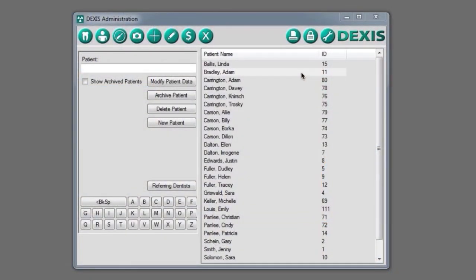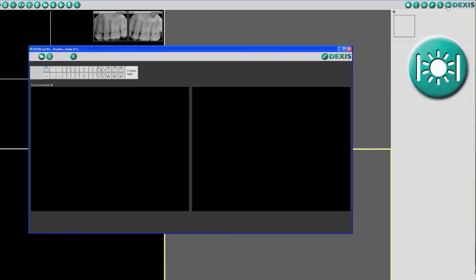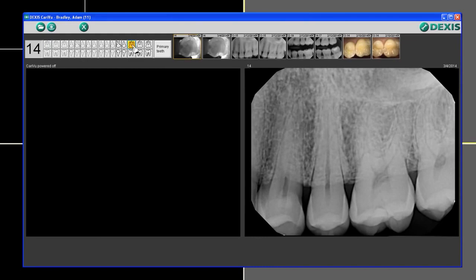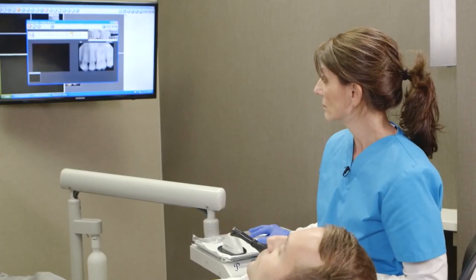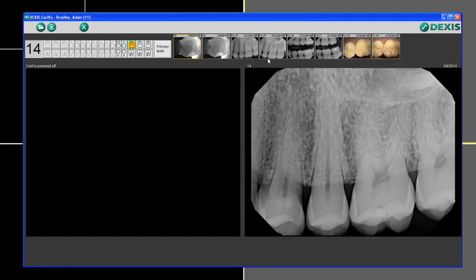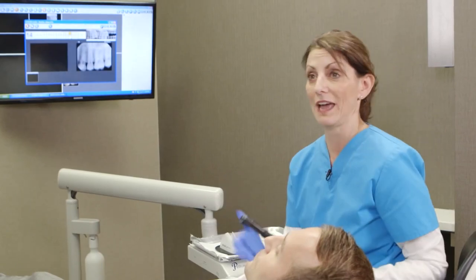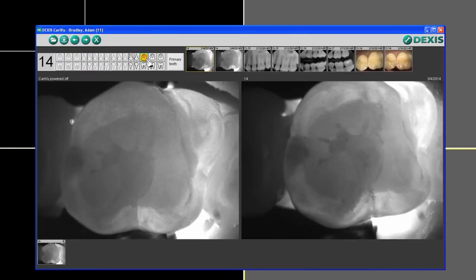Once I remove the CareyView I'm going to go to the computer — I'm in DEXIS. I'm going to click on the CareyView icon in the upper right-hand corner and it's asking me to select a tooth. I'm going to click on number 14, and you can see automatically that it's going to bring up any other images I might have with tooth number 14. If I didn't know the tooth I can wait until after my picture is taken and then number it.